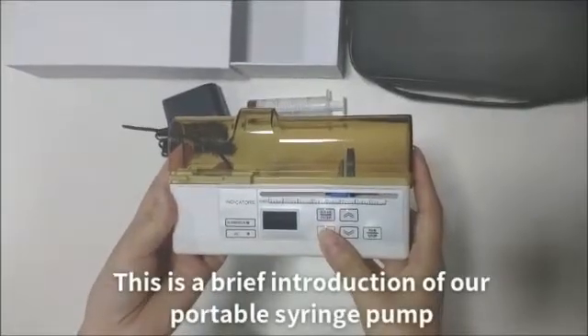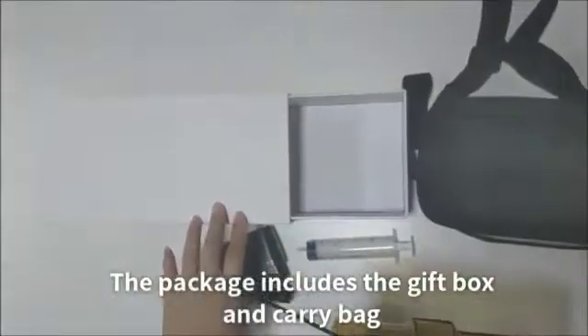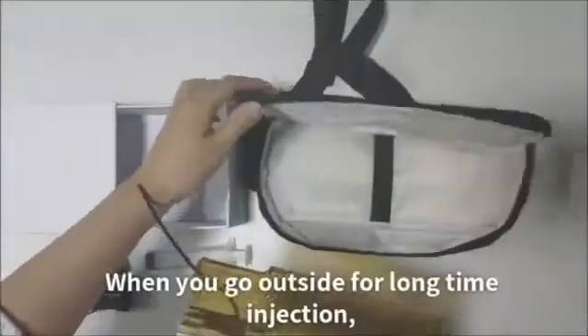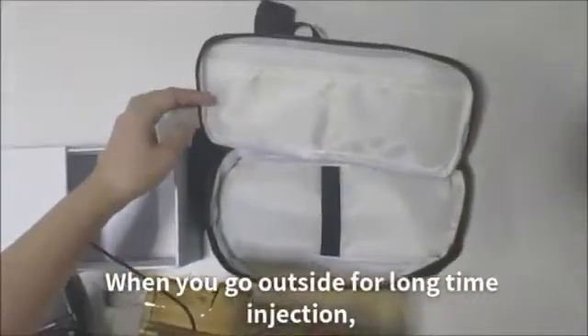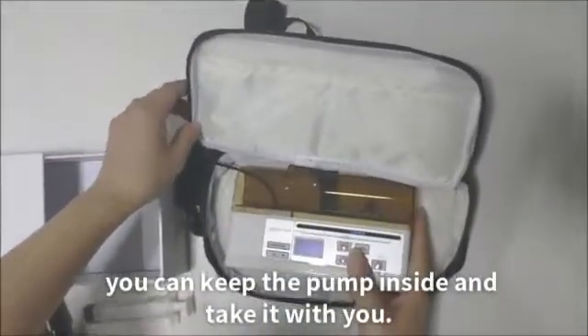This is a brief introduction of our portable syringe pump. The package includes the gift box and carry bag. When you go outside for a long time injection, you can keep the pump inside and take it with you.